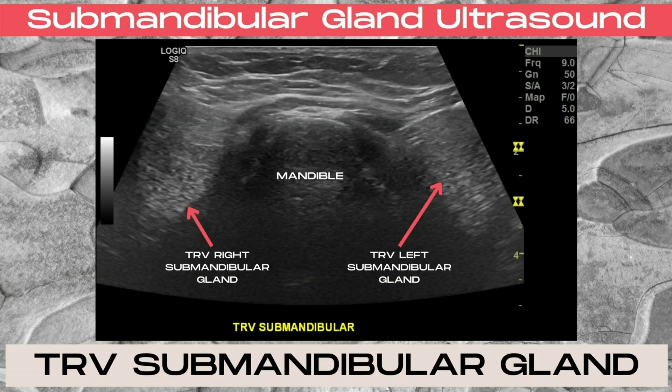To locate the submandibular glands on ultrasound, place the transducer below the chin in a transverse plane. From this view, you can see the chin or the mandible in the middle of the image as the dark hypoechoic area, and on the lateral sides of the mandible will be the transverse right and left submandibular glands, which are going to be hyperechoic and homogenous. To view each gland separately, slide laterally in a transverse plane from the chin bone and the gland will be visualized.